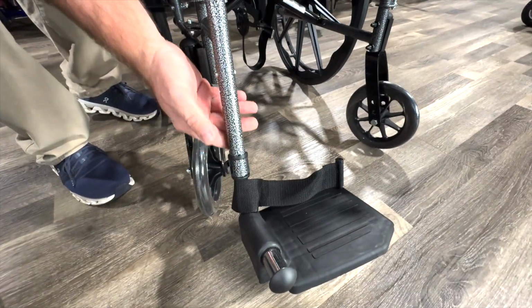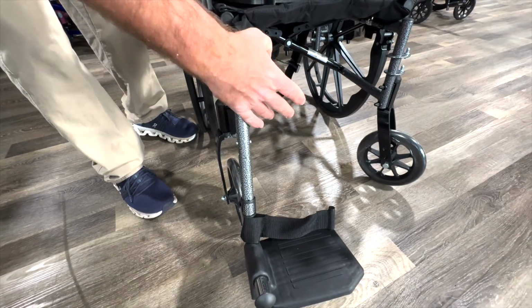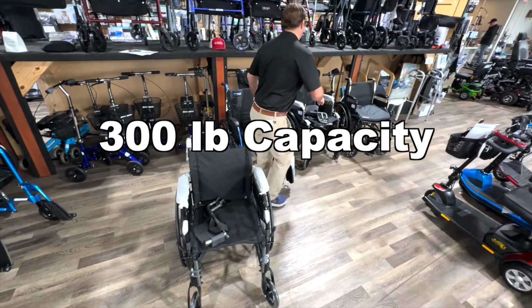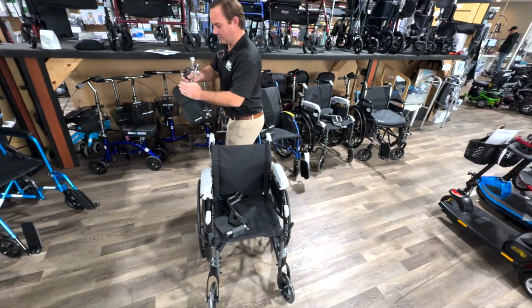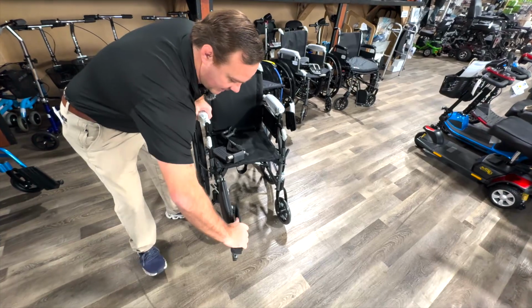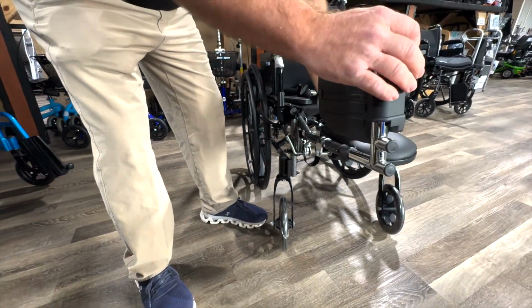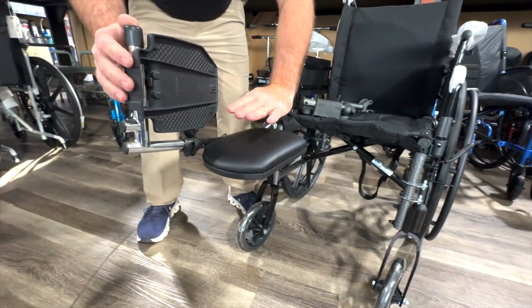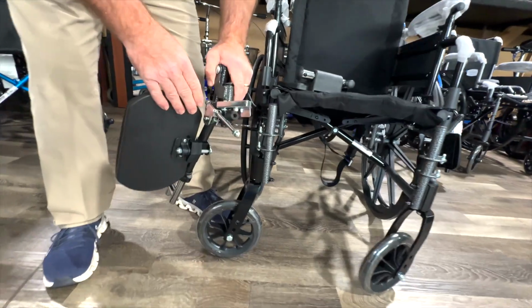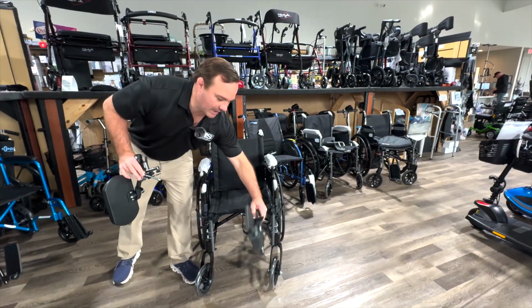These can be adjusted in height, but you swing them out to the side. You also, when you put them on, you come out to the side. Okay? But let's say that you have a broken leg or you need to get your feet up above your heart. You can get that chair with what they call elevated leg rests. So this just comes out here, and this can be adjusted down and up for elevation. Broken leg, usually when you elevate, you pull this in, you rest your leg right here. You still have some adjustments there too. So when you see ELR or elevated leg rest, that's what this is. And this is your standard swing-away. This will not adjust up.